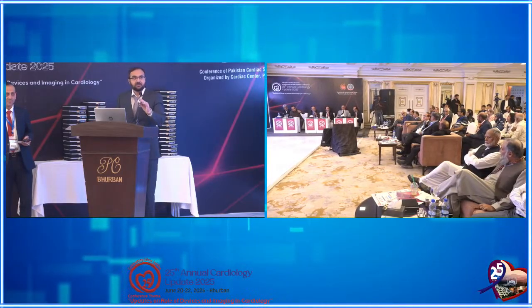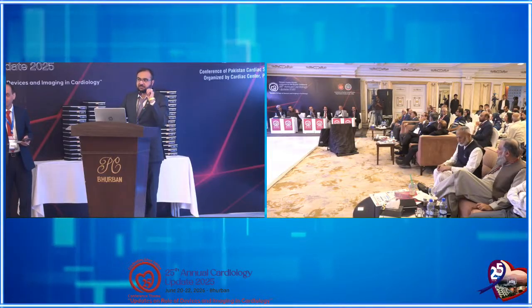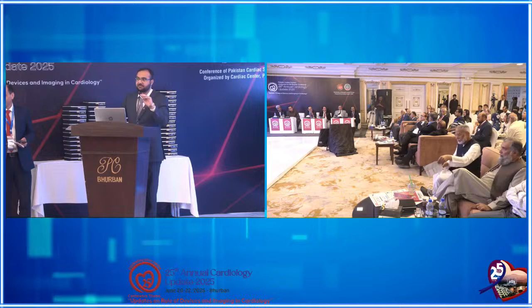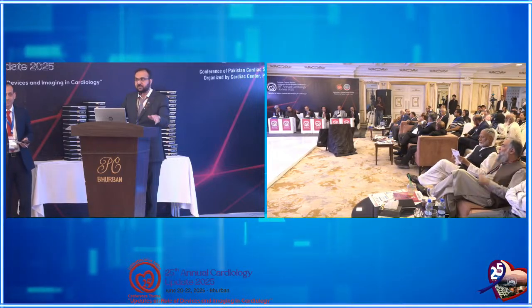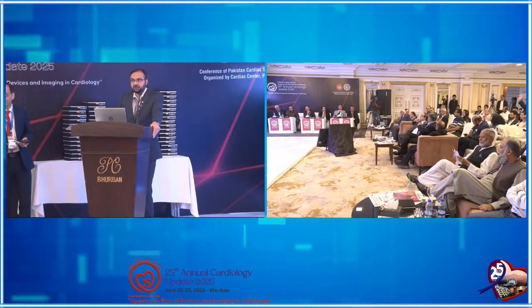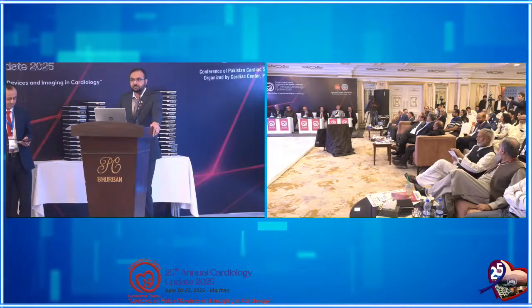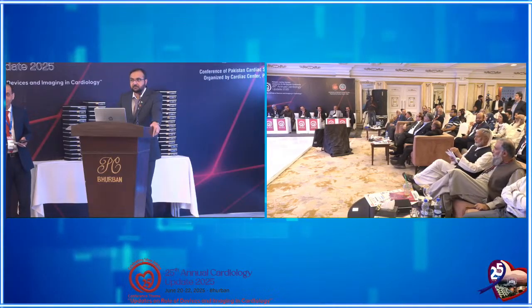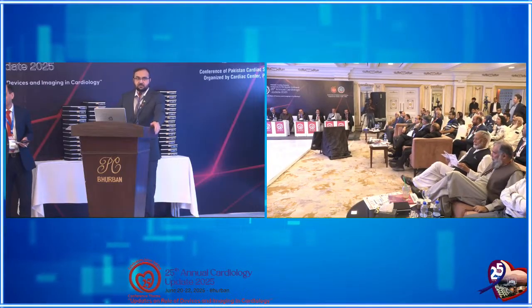ये जो कैथेटर है ये भी स्पाइरल सॉफ्ट है और मल्टीपल है. Yes. जैसे आप वायर निकालते हैं तो टच करता है. कैथेटर तो सॉफ्ट ही होगा पर टिप उसकी सॉलिड होगी. क्योंकि ये टिप पे नहीं रहे, इसके जो मल्टीपल लेवल पे रेडियो फ्रीक्वेंसी है. अच्छा ये शेप में स्पाइरल होगा, शेप स्पाइरल है, शेप में स्पाइरल हो सकता है. इनका जो ओरिजिनल था वो तो फेल हो गया था जो पहले, हो सकता है, पॉसिबल.